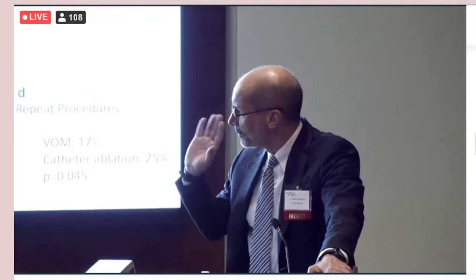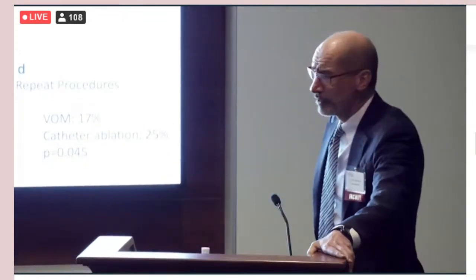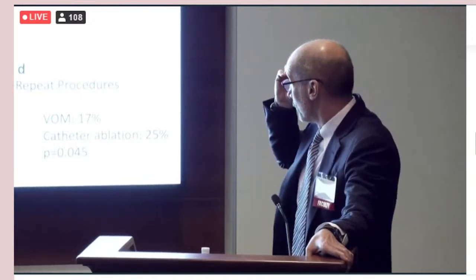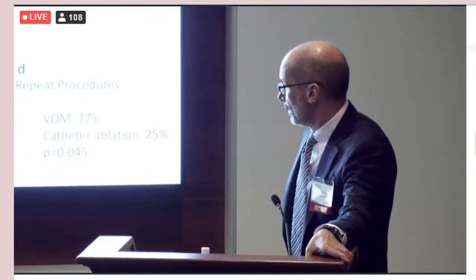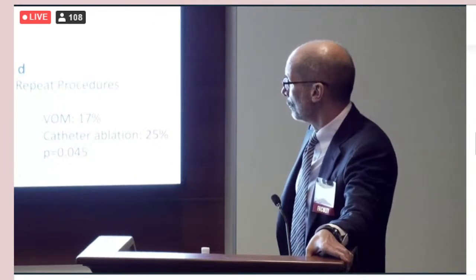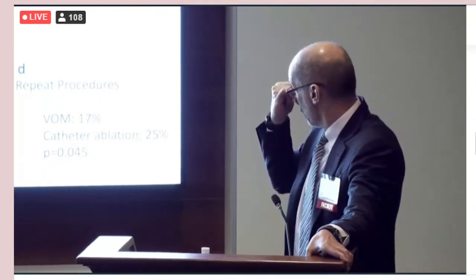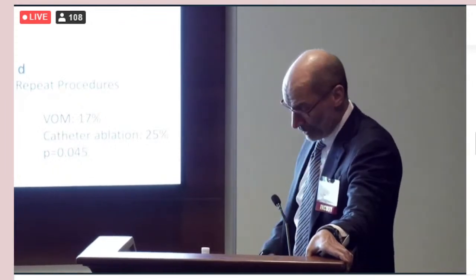Maybe here. Okay. So we'll be showing a case of vein of Marshall alcohol as part of ablation of atrial fibrillation. Some of my disclosures. A brief discussion as to why do this at all. We have evidence from randomized clinical trials supporting the idea that when you add vein of Marshall alcohol infusion to a conventional catheter ablation in persistent AFib, you get better results on follow-up.